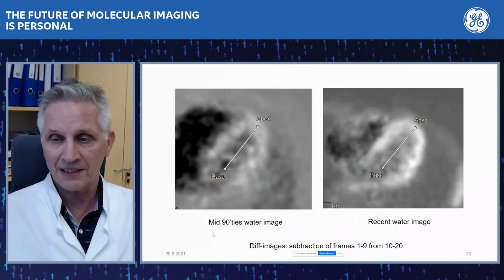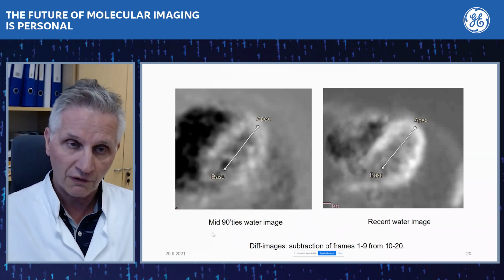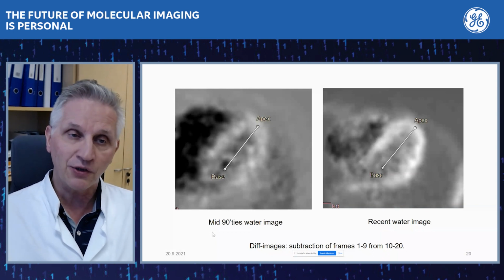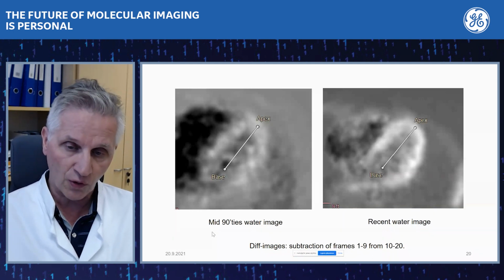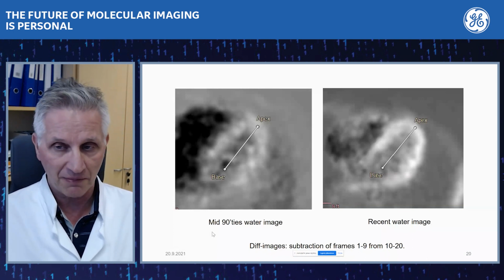What you can see easily is the image quality, because those who use radio water know that the water is very rapidly diffusing from the blood to the tissues, and then you need to create a kind of parametric image, or a so-called difference image, a subtraction image, which is then used for the segmentation.